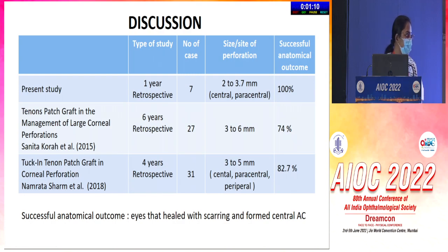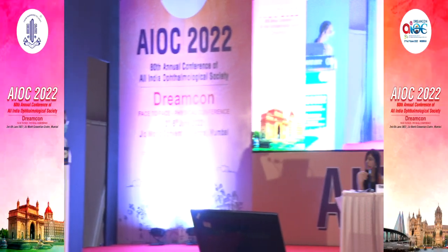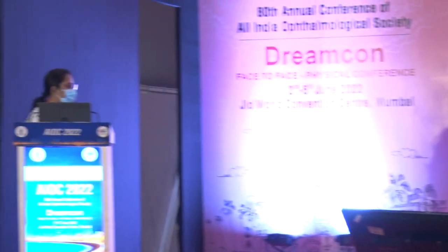Thank you, very interesting. Do you have any details on the type of suture that you took while the graft was placed? Was it like a mattress suture? What kind of suturing technique was used? In paracentral we used interrupted sutures, and for central we used figure of 8 sutures.